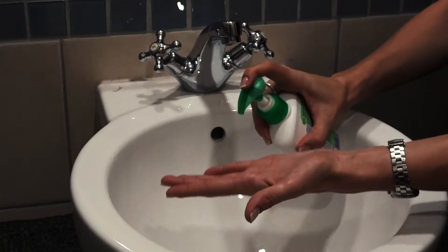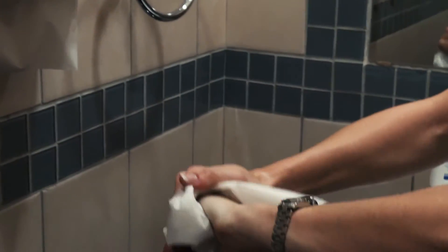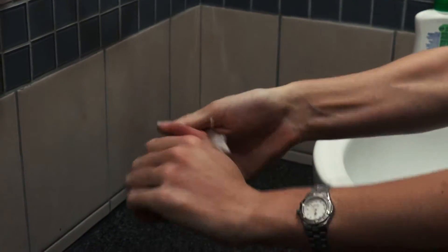Step 1. Wash your hands with soap and warm water and dry with a clean towel. It is important that hands are warm and dry as this improves blood flow and makes it easier to collect the blood sample.